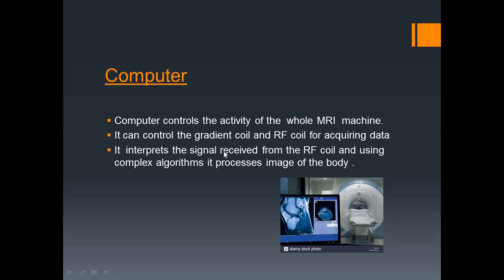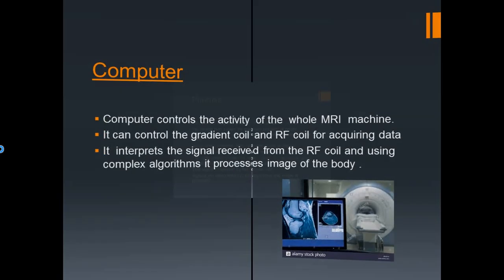Here is a picture which shows that the computer helps to produce images from the MRI machine.